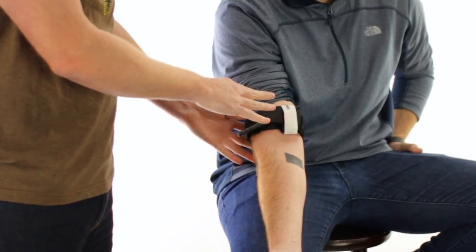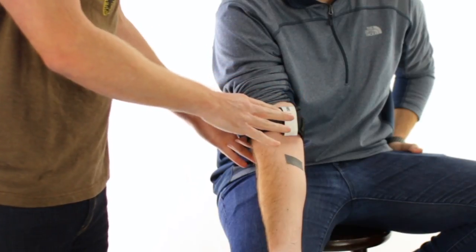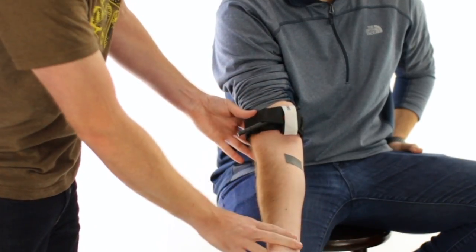Ideally this is going to be applied to bare skin, but it would still be effective if applied over clothing. Lastly, when the bleeding stops the radial pulse will also be absent, so make sure you give that a check.